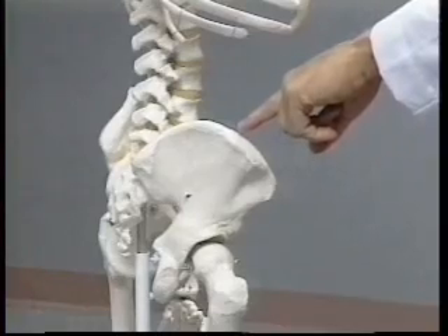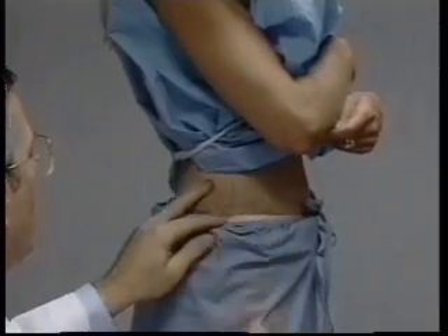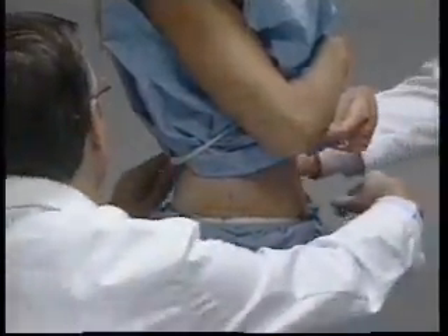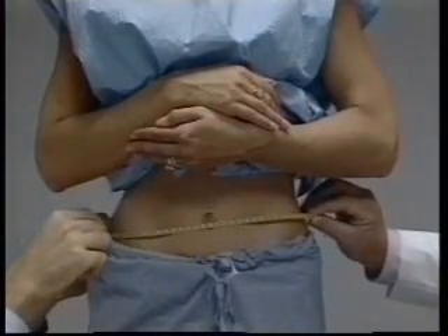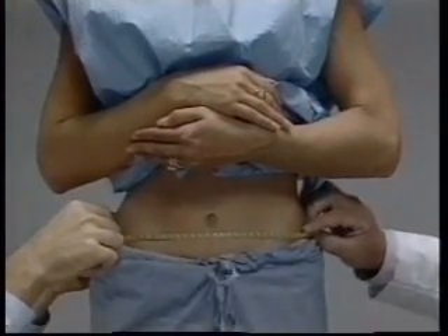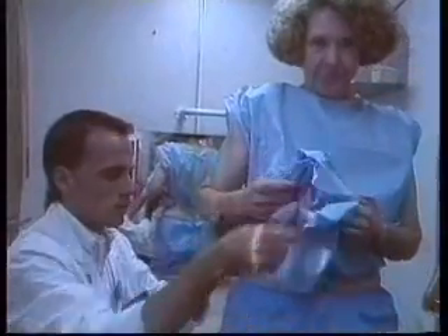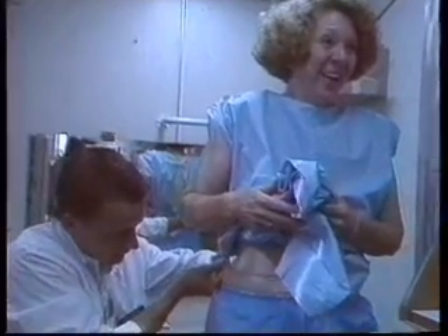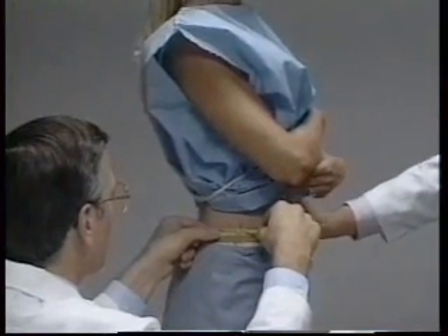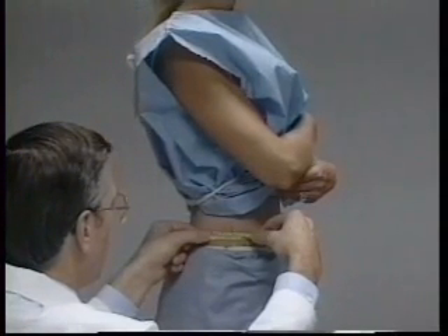Just above the uppermost lateral border of the right ilium, a horizontal mark is drawn and then crossed with a vertical mark on the mid-axillary line. The technician places the measuring tape around the trunk at the level of the mark on the right side, then inspects all sides to make sure the measuring tape is in a level horizontal plane. Mirrors on the wall are used to assure correct horizontal alignment, which is especially helpful for women with hourglass-shaped torsos and for overweight subjects. The tape is then tightened slightly without compressing the skin and underlying subcutaneous tissues, and the measure is recorded in centimeters to the nearest millimeter.